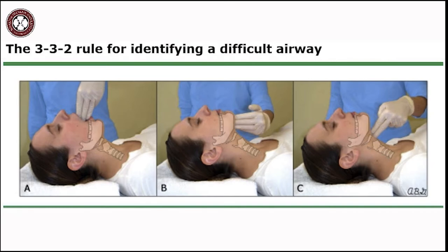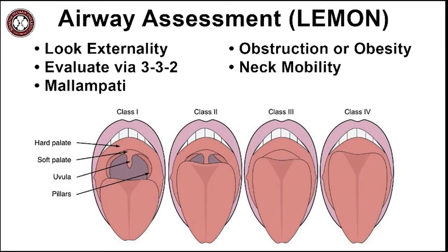If the space is greater than 9 centimeters, intubation may also be more challenging because the glottic opening can be too caudal to visualize. The two notes the ability to place two fingers between the thyroid cartilage and the base of the mandible. A rough estimate of the larynx location is obtained via this method. If two fingers cannot fit, the larynx may be too cephalad, so getting a good view of the glottic opening will likely be difficult.